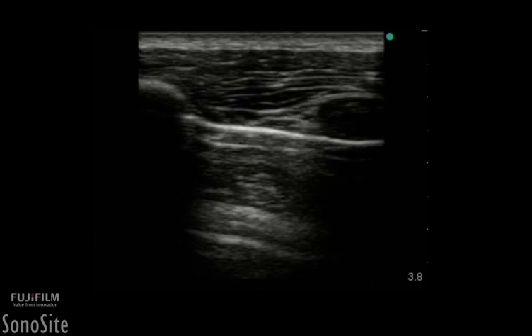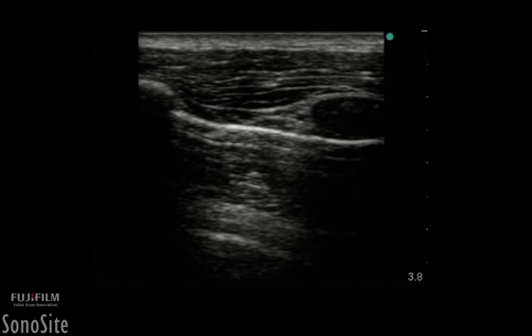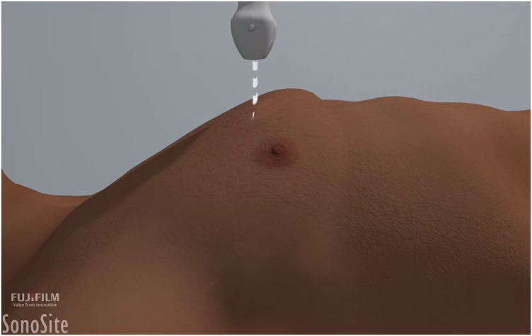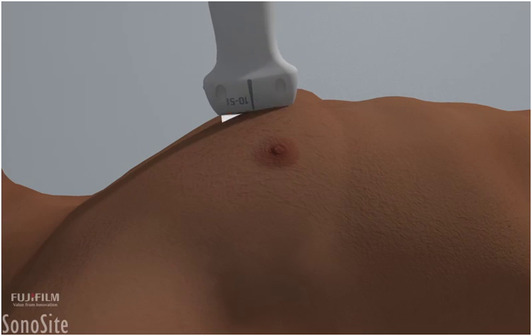In the case of a pneumothorax, air between the visceral and parietal pleura creates the separation and absence of lung sliding. To evaluate for a pneumothorax, one will use the high-frequency linear transducer, as this will provide the highest degree of image quality of the lung pleura.